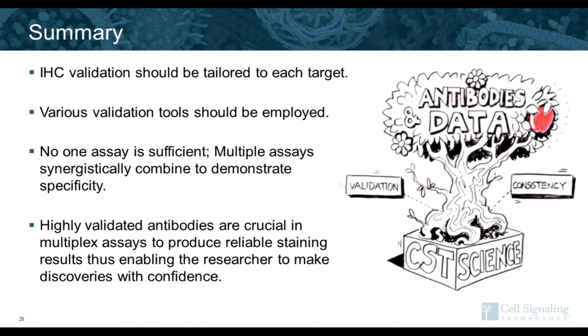As long as you have an HRP conjugated secondary antibody to detect your primary antibody, then you can use antibodies raised in any different species that you would like.